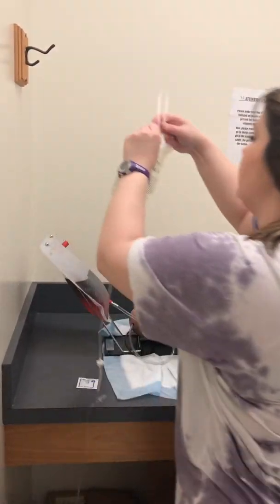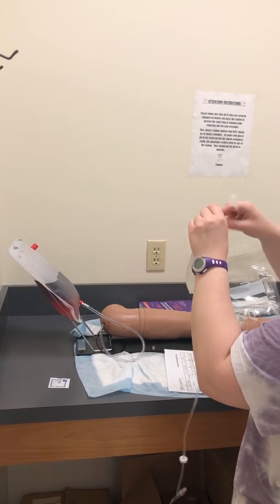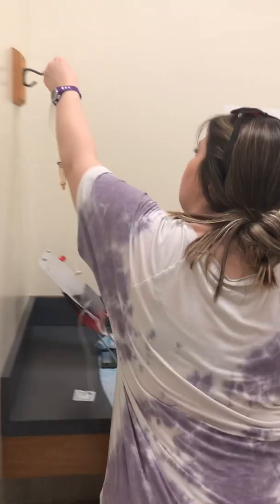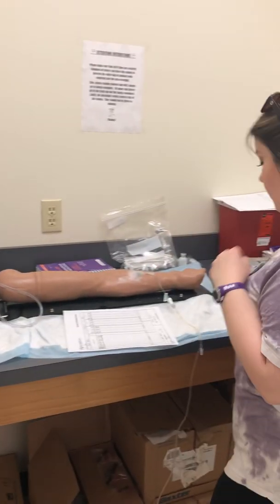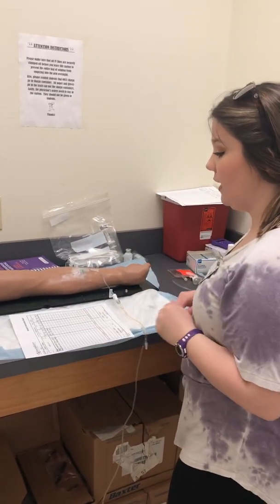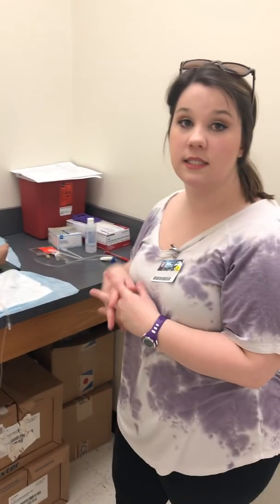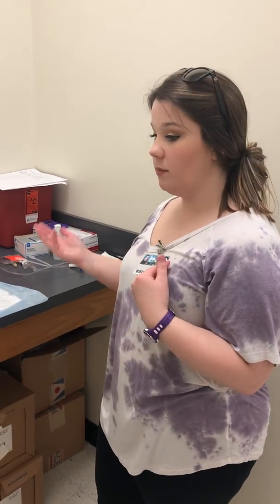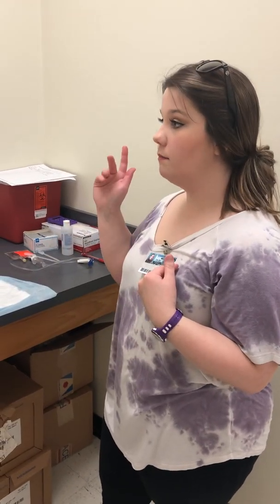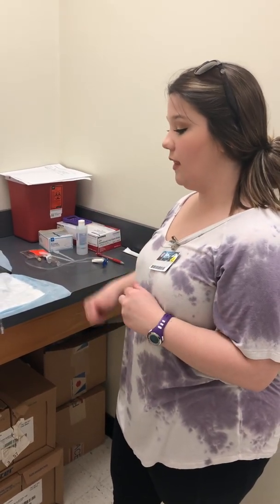I'm going to raise my primary, and I'm going to set it back to the normal infusion rate. Okay? Now that I've done all that, I'm still going to assess the site and tell the patient to report any dizziness, diarrhea, or muscle spasms. And I will be checking on the patient frequently. That's set back to the normal infusion rate, and now I'm going to go document.